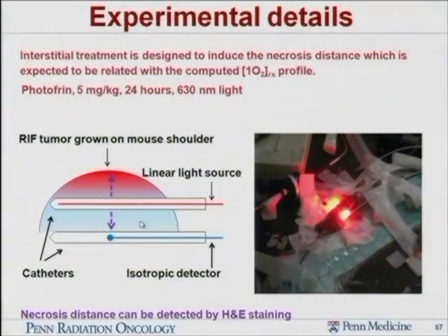In the mouse study, you can have a controlled environment where you can have a constant singlet oxygen concentration over the entire treatment time, which is not changing at all. And you can correlate each condition with the necrosis result. That's what we actually did. We correlate each condition where the singlet oxygen production is constant.